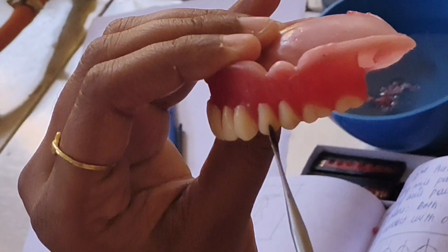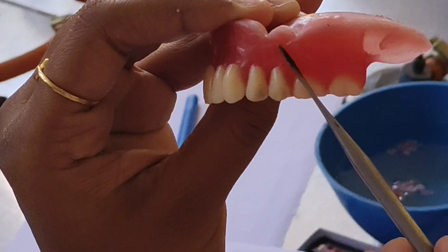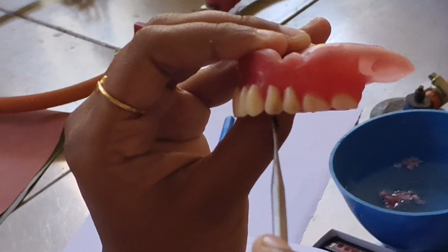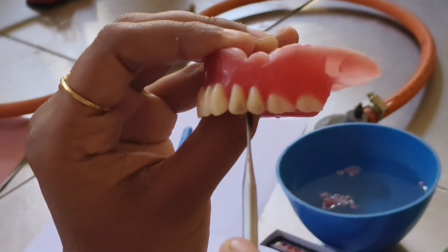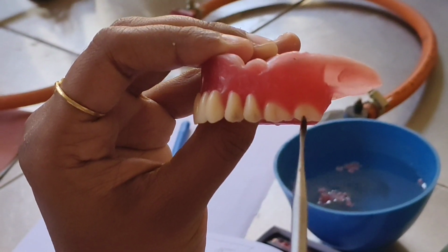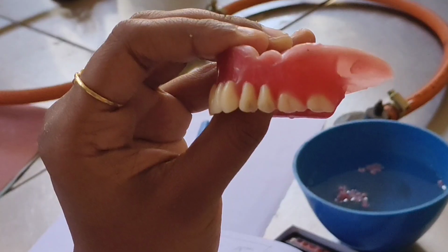Like for the first premolar this is straight, for the second premolar this is straight, for the first molar this is slightly tilted towards mesial. Because the palatal cusp of the first premolar is not touching, we cannot see it from here. But when we see like this, the palatal cusp is prominent and is touching the glass plate. Likewise for the first and second molar, the buccal cusp is a little bit above and the palatal cusp is more prominent.